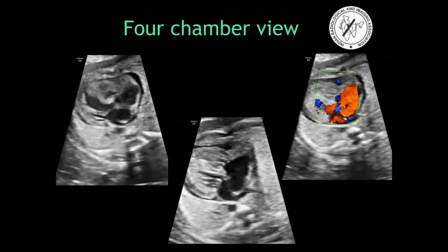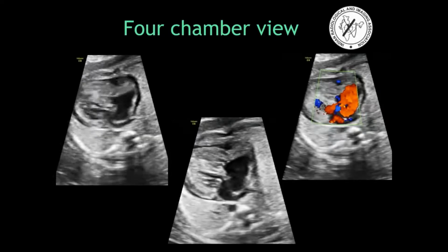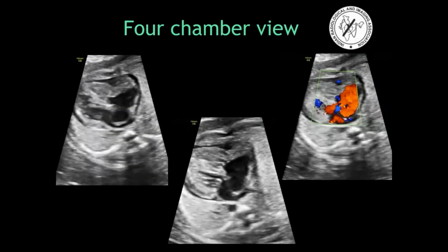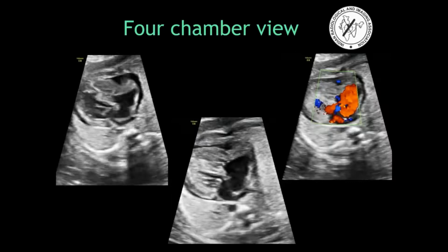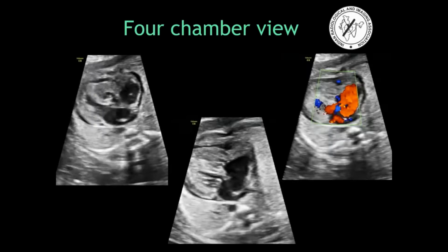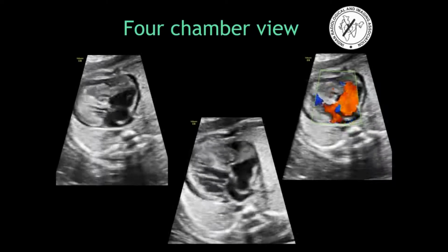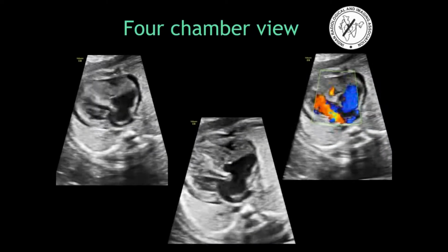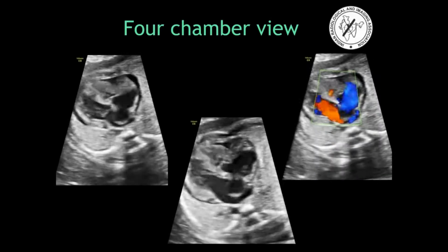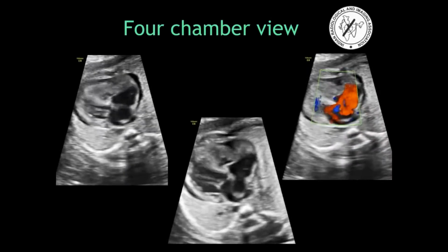In 4-chamber view, there is dilated right atrium, then persistently open foramen ovale flap in left atrium, then flickering movement of tricuspid valve with thick cusps, very small right ventricular cavity with thick wall, a compressed or small left atrial cavity, normal opening and closing of mitral valve, and normal LV function. On putting color, the left ventricle fills properly while the right ventricle fills very minimally through the dysplastic narrow tricuspid valve.